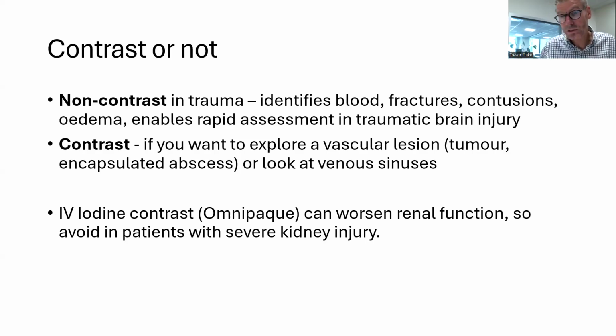But again, you don't need to give it all the time. And the reason why it's good not to give it in certain circumstances is because it's not benign. Very rarely, patients can have reactions to contrast. It's iodine-based, Omnipaque is iodine-based. You can have rare reactions to it, which can involve vomiting or even anaphylactoid reactions. Anaphylaxis to contrast can occur.